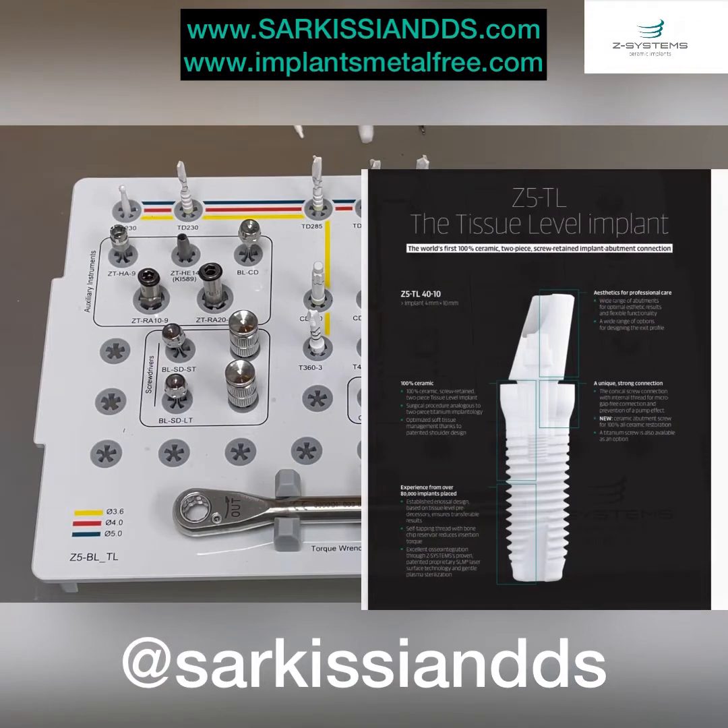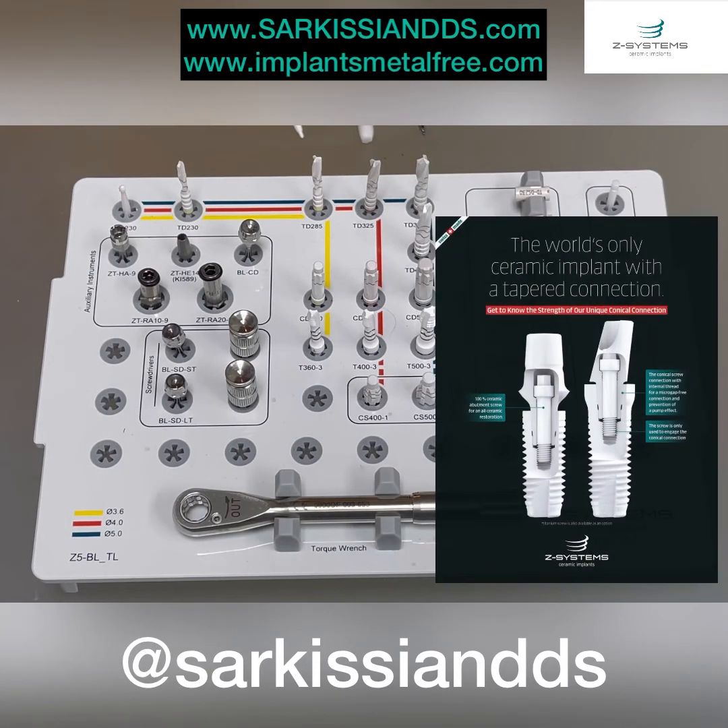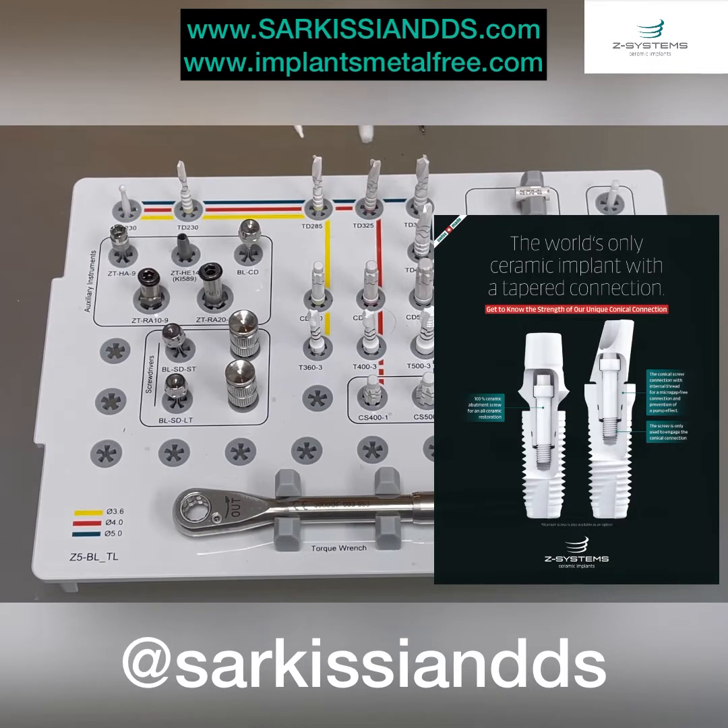Hello everyone, this is Dr. Joseph Sarkisian. We're going to present the general tissue level and bone level drill kit for Z-Systems.